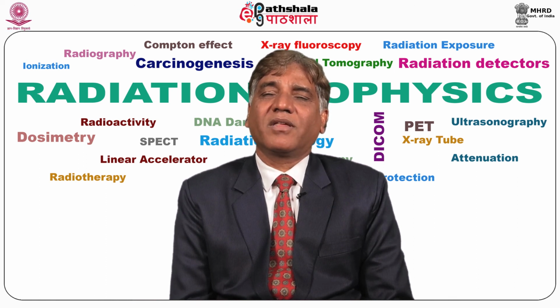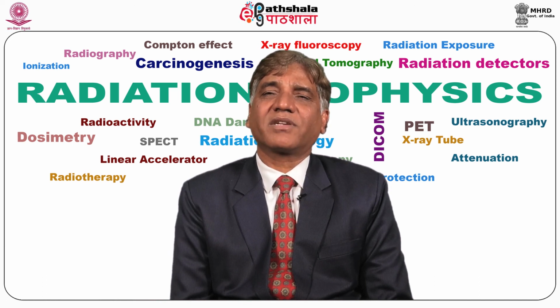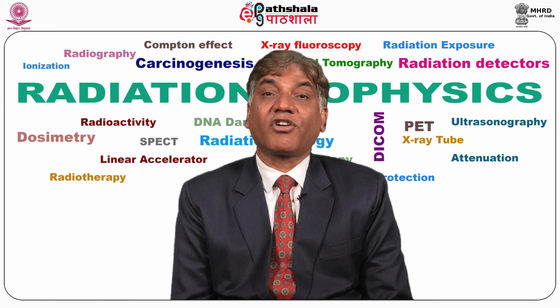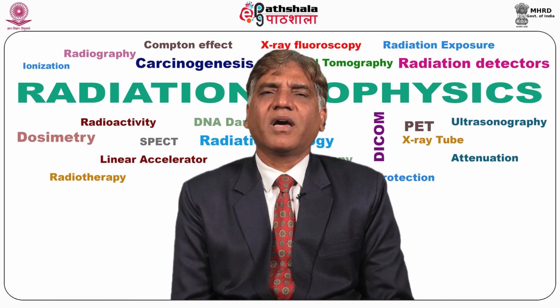Doppler may not be used for a stationary structure, because in case of a stationary structure, the frequency of sound wave transmitted and reflected is the same. There is no change in the frequency, whereas with flowing blood there is a change in the frequency of transmitted and received ultrasound waves, and this Doppler shift is utilized to get information about the blood flow.